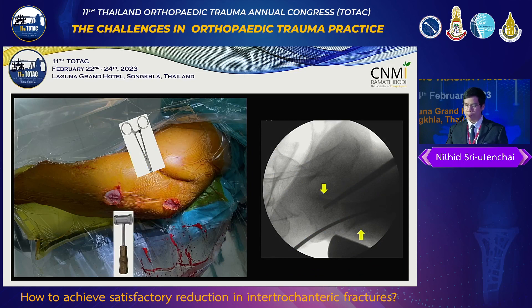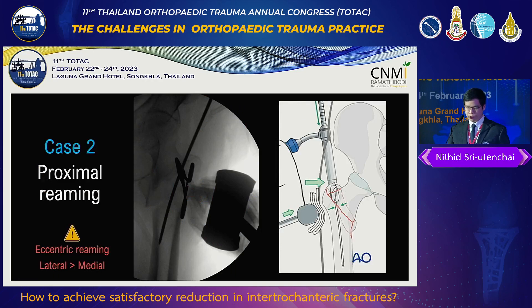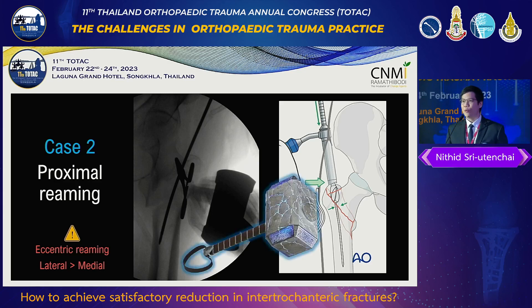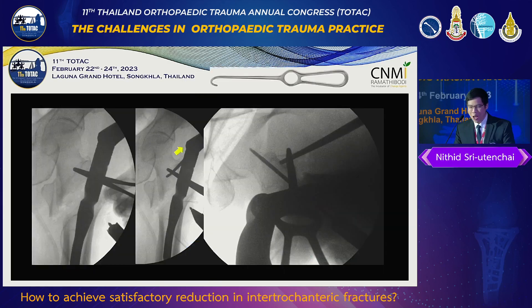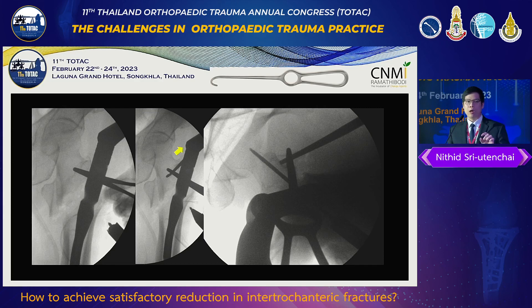I controlled the proximal fragment with the Kocher clamp and pressed it down, then used a hammer to elevate the distal fragment up. The lateral fluoroscopic picture confirmed acceptable alignment. Before performing proximal reaming, I used a hammer to compress the fracture site at the lateral side, which I will explain the importance of later. After nailing, a gap was found, so I used a bone hook inserted through the nail entry point incision to minimize the gap and restore AP alignment.